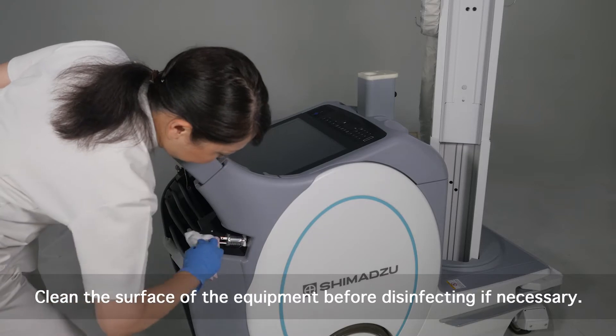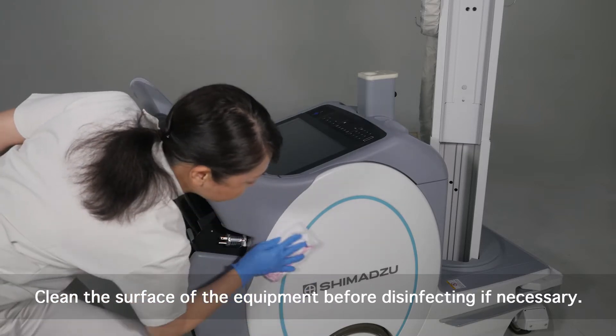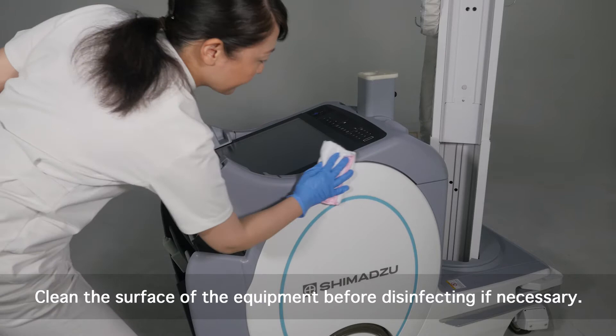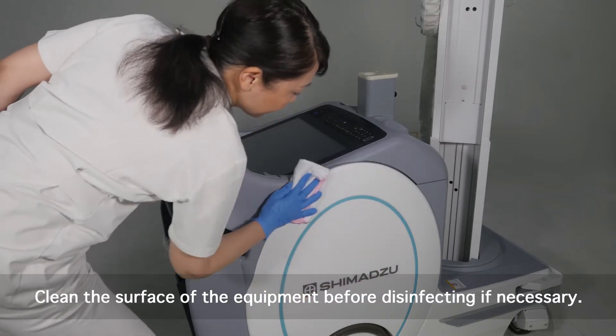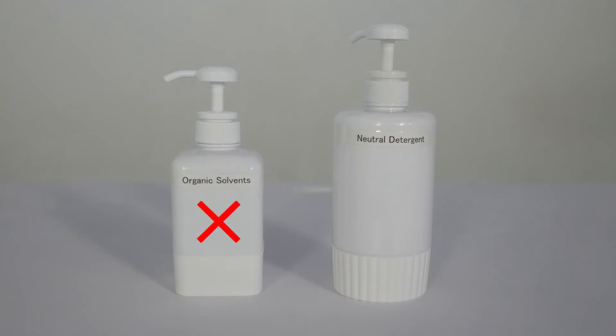Wipe the surface with a cloth lightly moistened with a cleaner. After applying the cleaner to the cloth, wring it out well. Do not use an organic solvent. Dilute neutral detergent with water or lukewarm water before use.